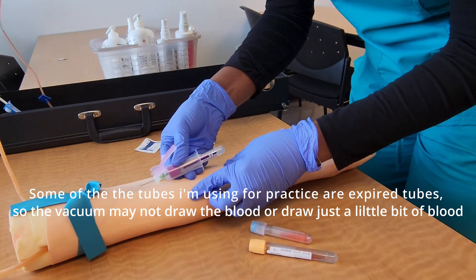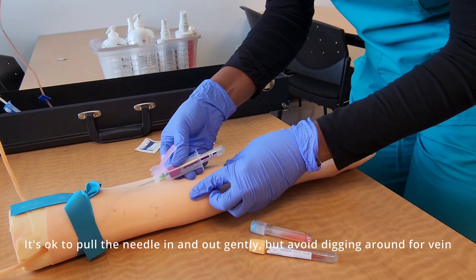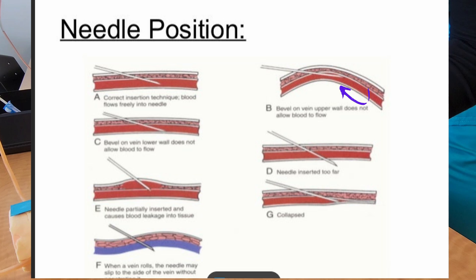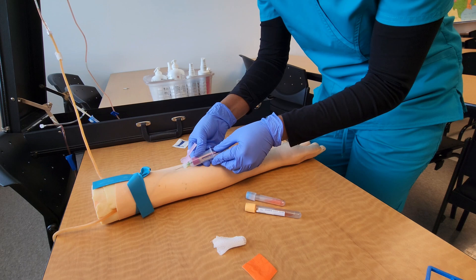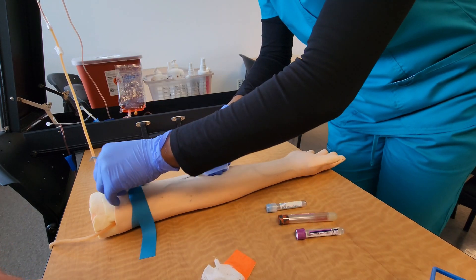After inserting my last tube, I realized I wasn't getting any blood, so I moved the needle slightly back and forth to reposition it in the vein. Sometimes you may pull back the needle when removing a tube, so you might need to advance slightly forward to re-enter the vein. Other times, pushing a tube in can push the needle out, so you'd need to pull back a little to reposition the bevel in the vein.